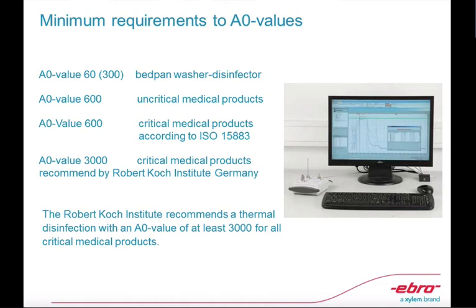So these are references of what are the acceptable disinfection values for bedpan washer disinfectors, for non-critical medical products, and for critical medical products, according to ISO 15883.